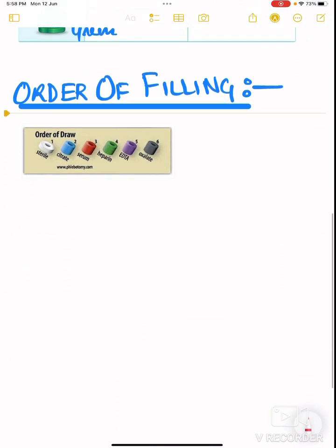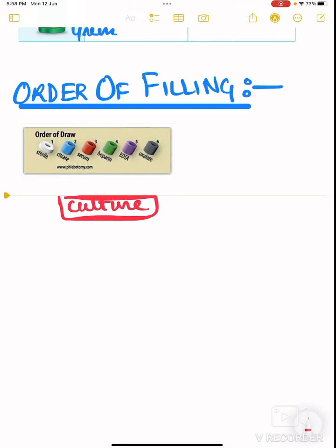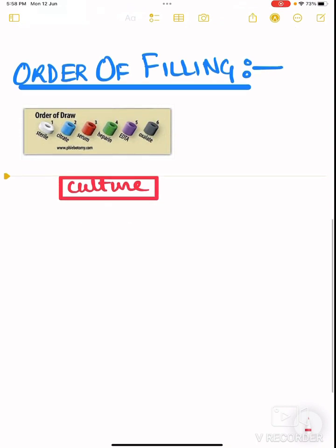So first of all, if you are drawing blood from a patient, then in what order will you fill the Vacutainers? First of all, we will use it for culture. Why will we use it for culture at the first step? Because I don't want the needle to touch anywhere before I collect the blood for actual culturing. If I touch the needle in the vial and then I put the blood for culture, it will cause false positive results. The needle may get contaminated. That's why the first blood should be given for culture.